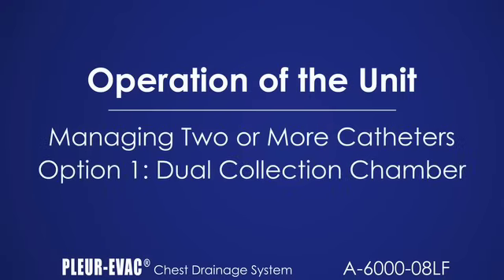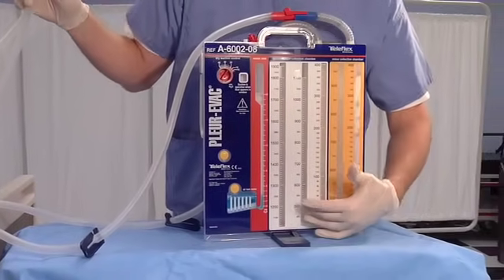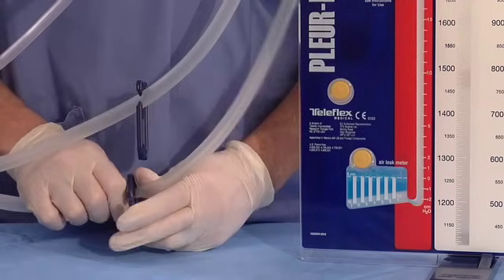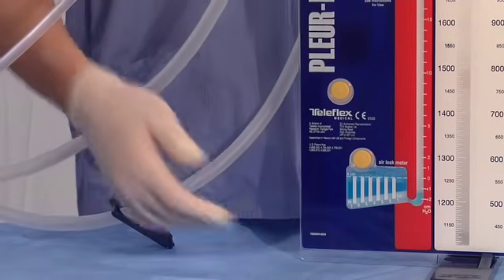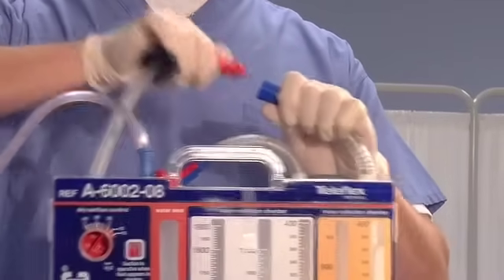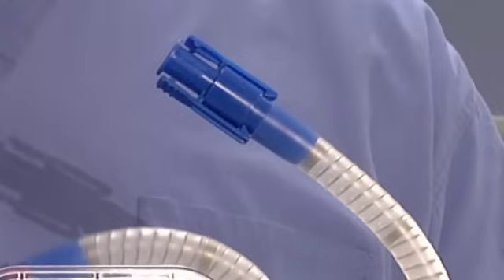Option 1 is to utilize a dual collection chamber model which has two separate patient tubes and two separate collection chambers. With this device, drainage can be measured from each chamber. To identify the source of a patient air leak, tubes are pinched separately to determine from which catheter placement the patient air leak may exist. If the intermittent bubbling stops in that tube when pinched and resumes when released, that would indicate the air leak still persists there. To remove one catheter, it is imperative that the corresponding patient tube be removed and the catheter must be clamped to ensure a closed system. PE-105 is an accessory plug that may be inserted into the blue connector of the removed patient tube to maintain a closed system.